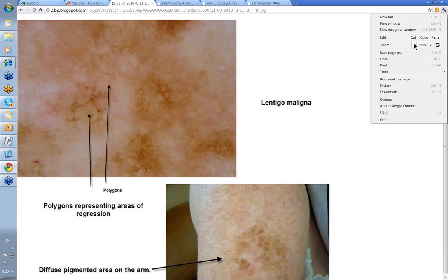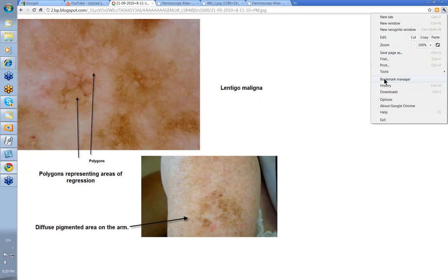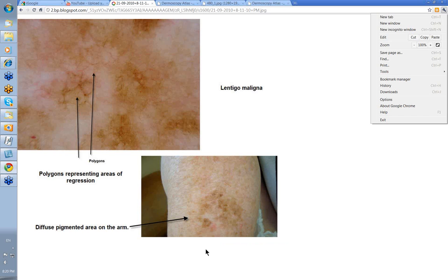The clinical is actually quite gauging - it certainly suggests that there's something atypical here. You can see this multicolored lesion, some darker areas, some clearer areas within it. I think this was on an arm, a diffuse pigmented area. You'd have to be awfully careful how you biopsy this to arrive at the right diagnosis, and this is where dermoscopy can help you. You wouldn't want to do a punch in here as you could easily get an unrepresentative area. Sometimes a large shave in the areas where you see these polygons can be a useful way of diagnosing this type of lesion.